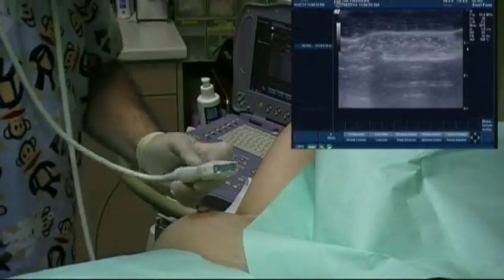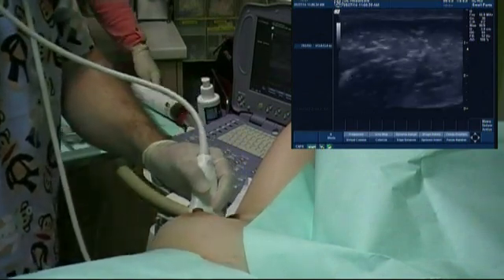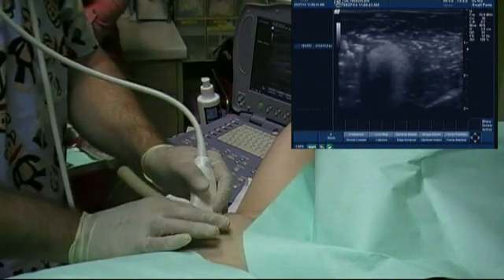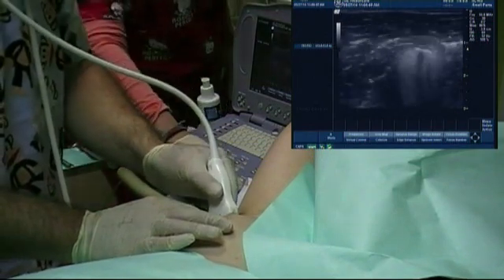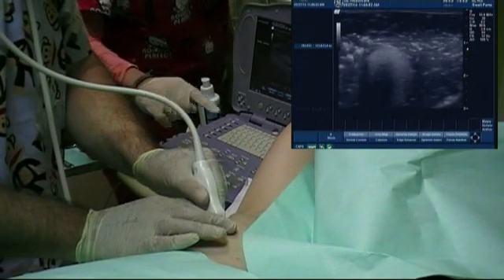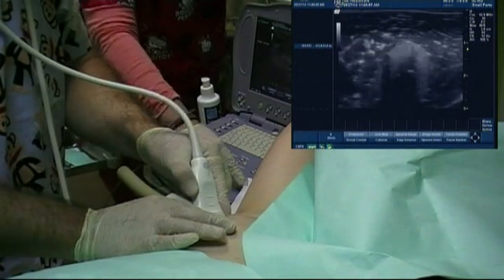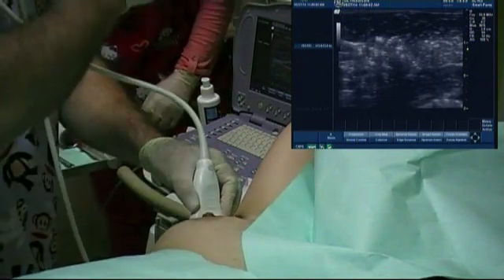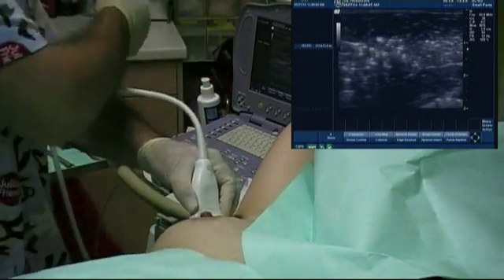We only use a small amount of gel, just enough to cover the probe, since excess would make the area slippery and our hands may move unintentionally. Before we start, we should locate the lesion and try to immobilize it in its greatest diameter, centered in the middle of the screen. If you prefer, you can move the lesion one to two centimeters from the tip of the probe to minimize the travel of the needle. Always make sure that the edge of the probe is cephalad-caudal oriented if possible.